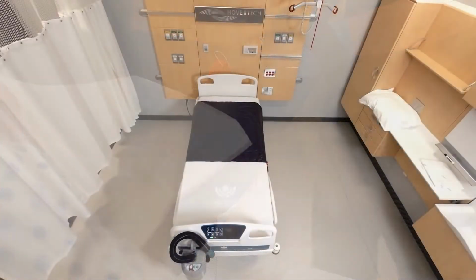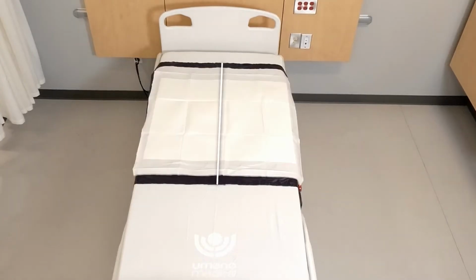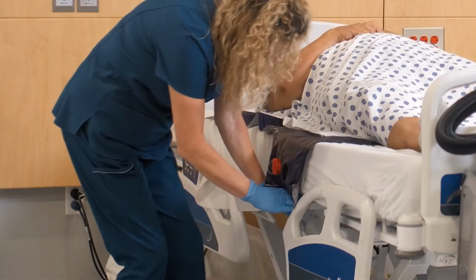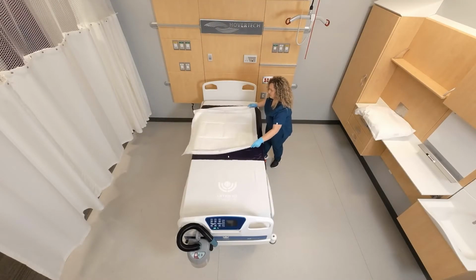It is ideal to place the Q2Roller on the bed prior to the patient. Align the Q2Roller center line to the middle of the bed. Place the top edge of the Q2Roller approximately where the middle of the pillow will be placed. Tuck the apron edges under the mattress to secure the Q2Roller. Place the half-size hover cover over the Q2Roller.